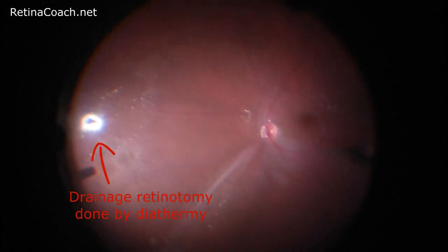Drainage retinotomy may be used when the primary retinal break is not seen or does not allow removal of most of the fluid. Also, drainage retinotomy is used in cases where subretinal fluid is planned to be removed over the posterior pole without perfluorocarbon liquid usage.